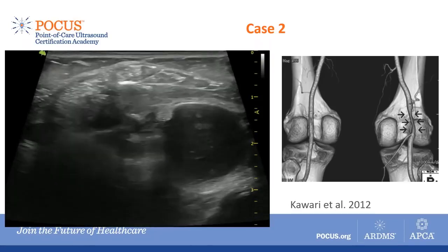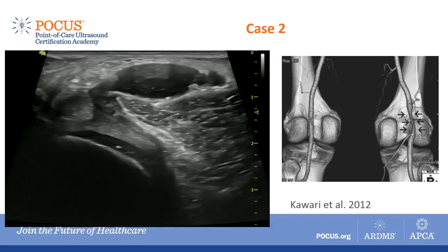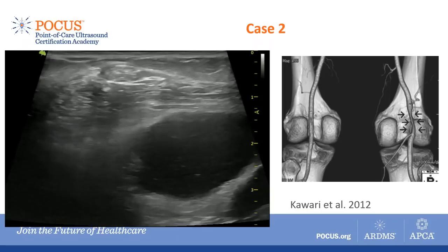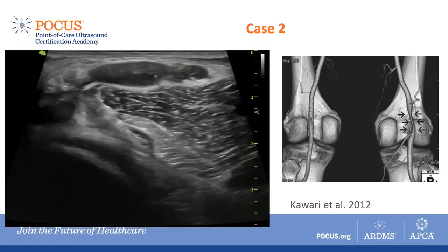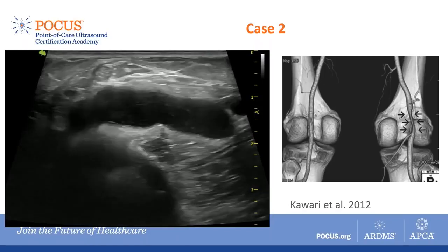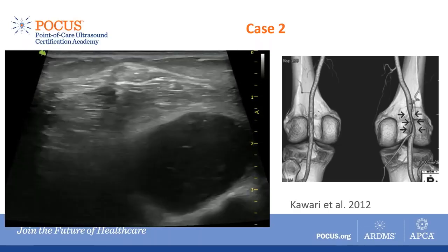So the only thing that I can detect as a physio, because I'm not trained as a medical doctor, is that I can see that there's something there, and I can see it's not, how do you say this, it's not arthrosis or osteoarthritis, you call it in English, I think. But I see it's not within the normal scope of what you would expect. So this is just detecting that it's abnormal and then referring on to the hospital. So I referred her actually to a rheumatology department because they're trained in arthropathies, and they will diagnose what it actually is. But it could be chondrocalcinosis, yes. But as I said, I'm not trained to make that diagnosis, and so I won't make the diagnosis.